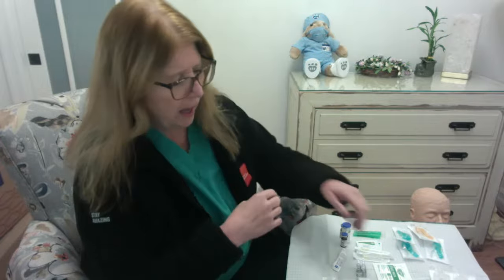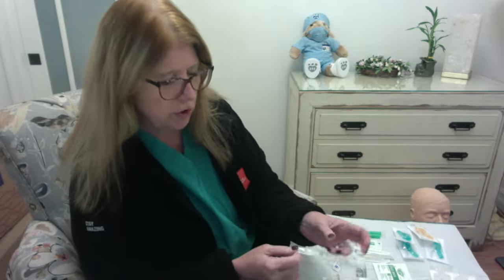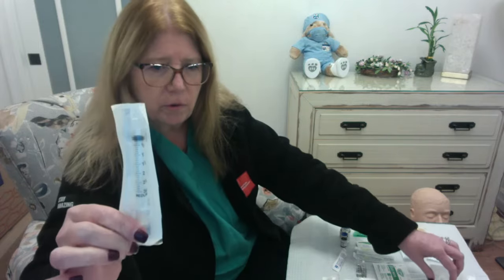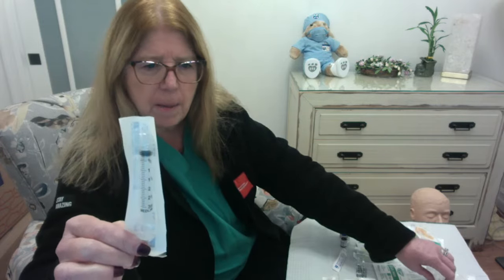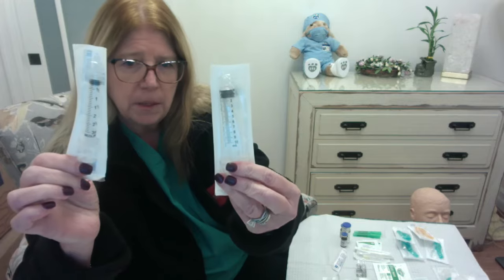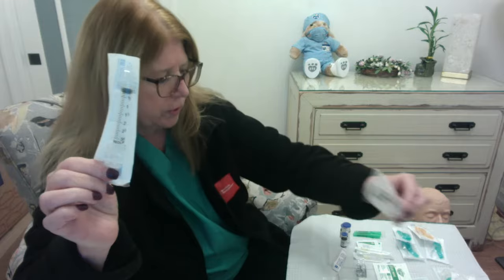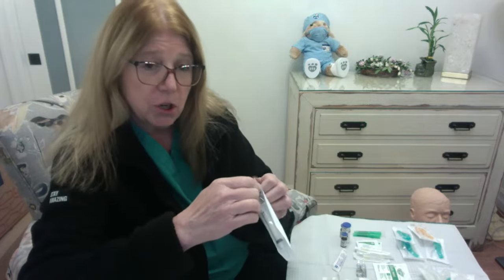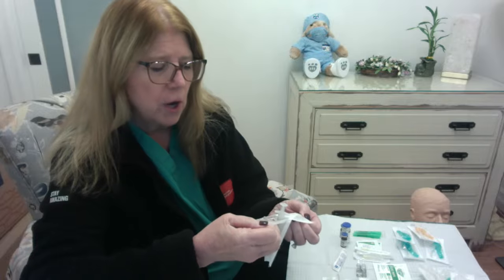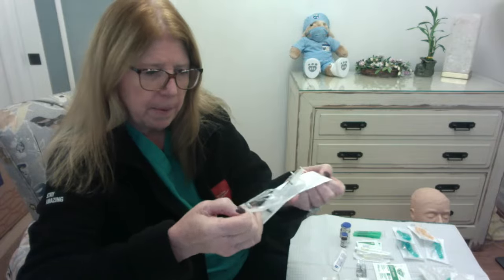So certainly we have syringes and needles. Syringes come in different sizes, right? This is a 3 milliliter syringe. This is a 10 milliliter syringe. You'll notice that there are calibrations or markings on the barrel of the syringe. And again, these open by peeling them down.